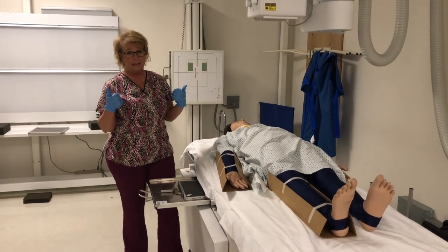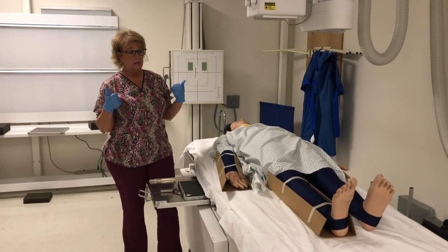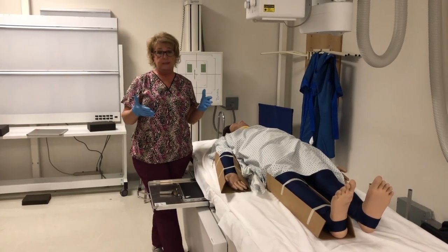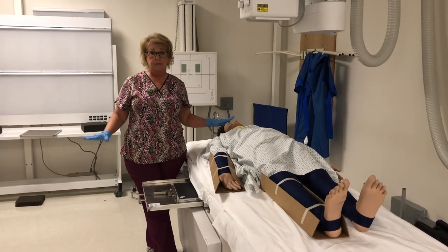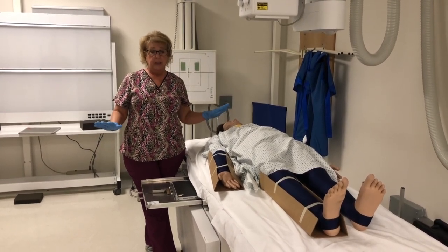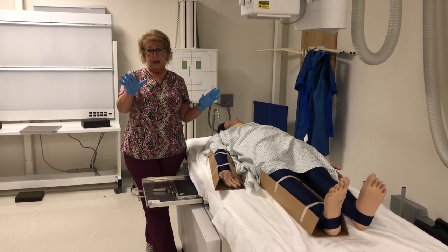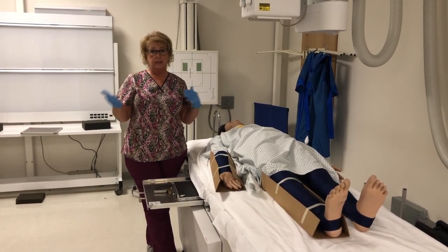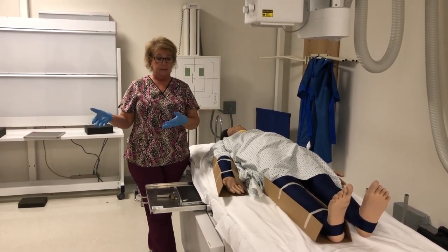If I was by myself, I would do everything with one set of gloves on, and then when I was done, I would wipe everything down. But if I tag team with another coworker, I can limit that cross-contamination between bloody patient and equipment.